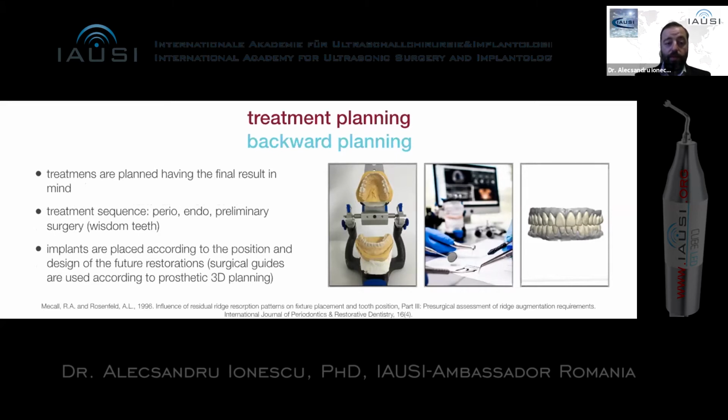So treatments are planning, always having the final result in mind, also with respect to the patient, and also with respect to our team work, as we need to be very precise when we choose the right steps of the treatment plan. And implants always are placed according to the position of the future restoration. Now, since we are using the surgical guides, we have the possibility to use the digital workflow and place the implants in the right position.